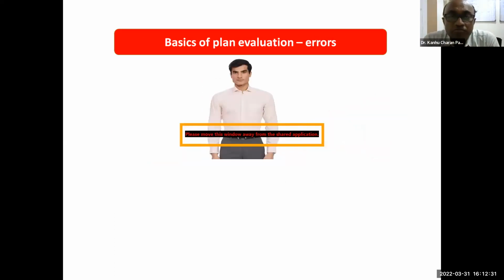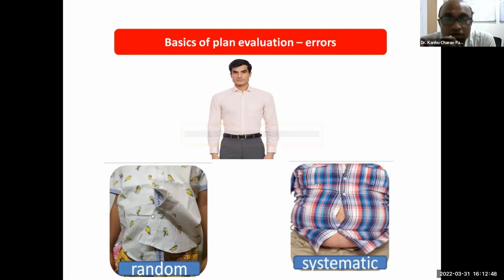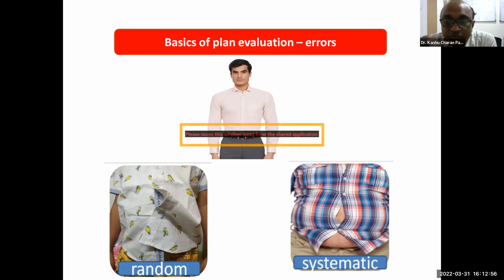There are two errors we find during treatment: one is the systematic error, and one is the random error. I have given a very good example here. The top picture is the perfect picture, the left is the random error, and the right one is the systematic error. Random error is the day to day error. Systematic error, once it occurs, will run throughout the treatment.